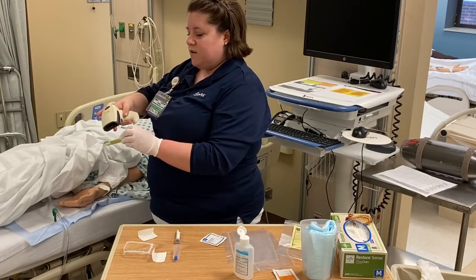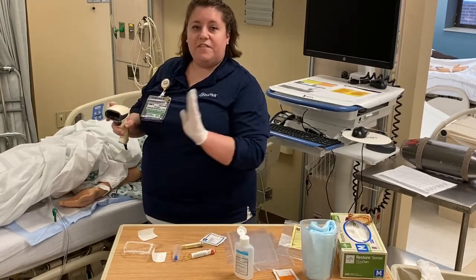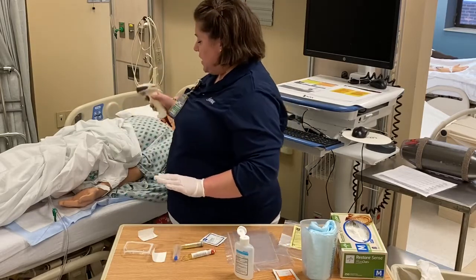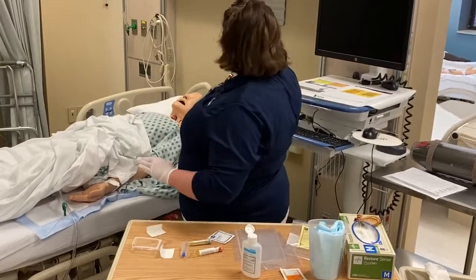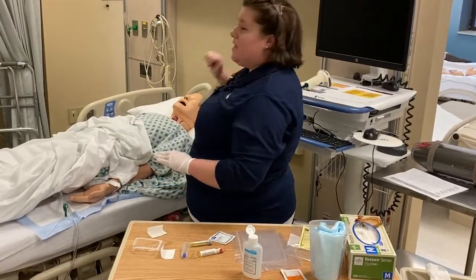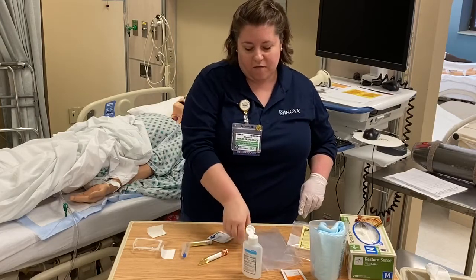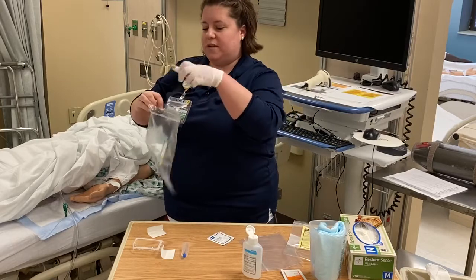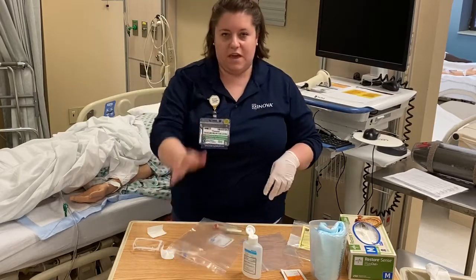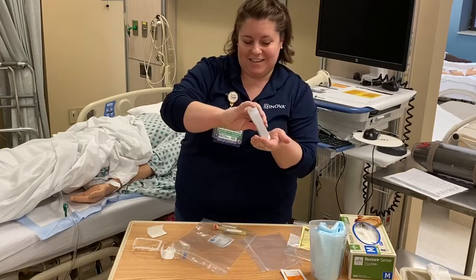I'm going to scan my tube, beep, beep. And then to finish out the entire process, I need to scan my patient's bracelet again, beep. And if I look at my computer, I'm gonna see everything is complete. And then I'm actually gonna take my hand that does not have my glove on, gonna use it to open my bag. I can drop my tubes in, put that down, take my other glove off, wash my hands.